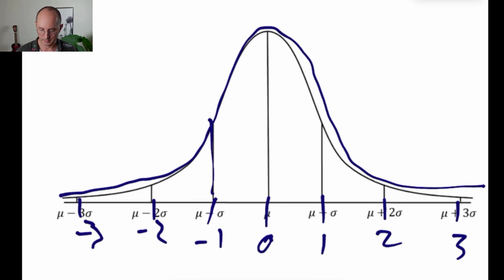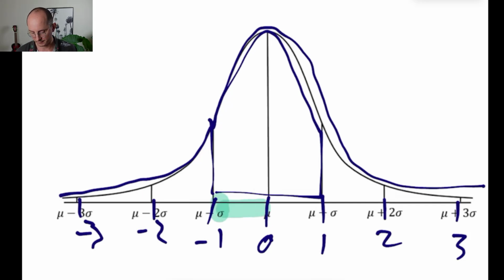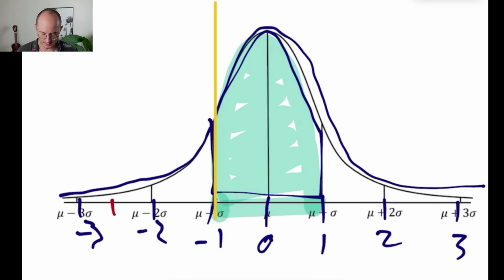The middle here is where most men sit, right? That's why the line is the highest in the middle, because there's the most amount of people there, between a -1 and a +1. This right here is the normal range, and most men fit into that area. Now, if your T-score is -1 or below, that's called osteopenia. If we go down here to a -2.5, then that is osteoporosis below that.